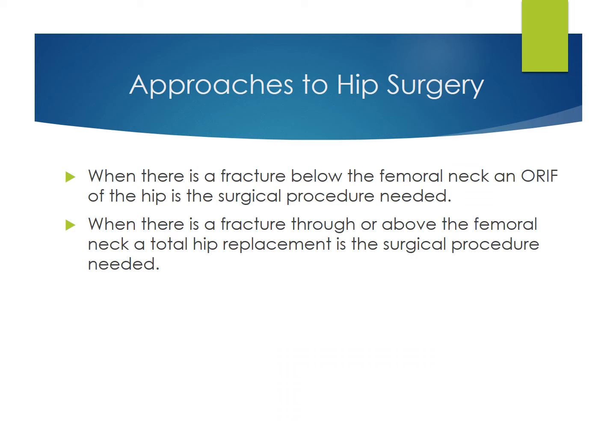Approaches to hip surgery. When there is a fracture below the femoral neck, an ORIF of the hip is the surgical procedure that is needed. When the fracture is through or above the femoral neck, a total hip replacement is the surgical procedure that is needed.